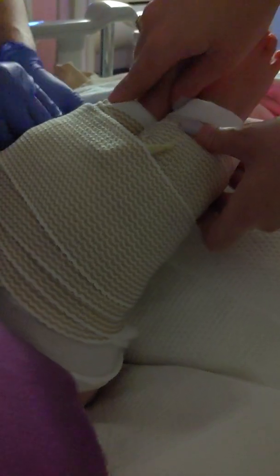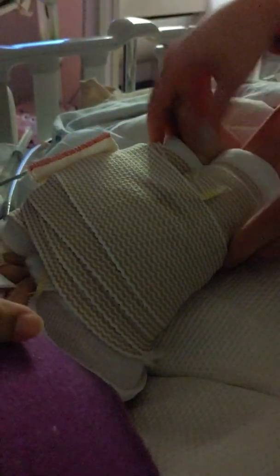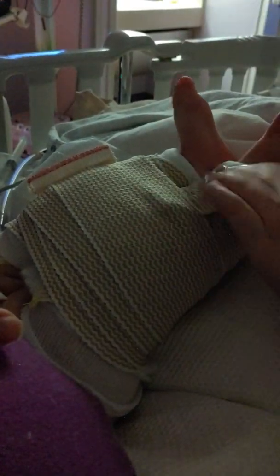So the rotation upward/forward doesn't hurt, but you just don't want them coming out. Exactly. So lifting up is okay, and the up is a little better for his nerve, honestly, that nerve in the front, because it always gets stretched when we rotate. Right. And the rotation doesn't matter, it's purely the opening. Yeah, exactly. The up, down, totally fine, rotation, totally fine. Okay. Good. That makes sense.